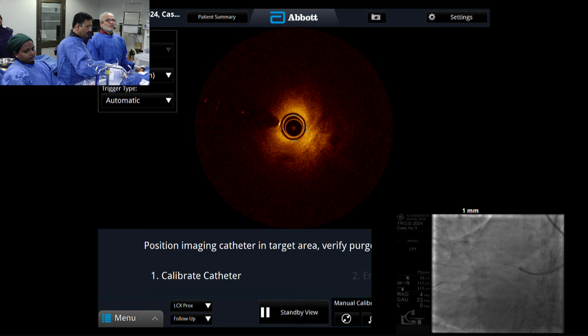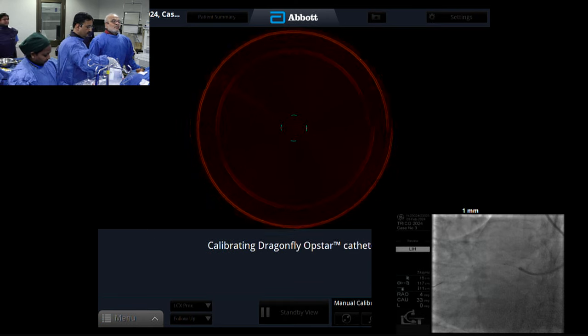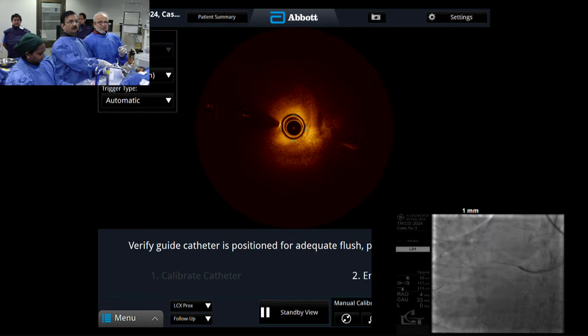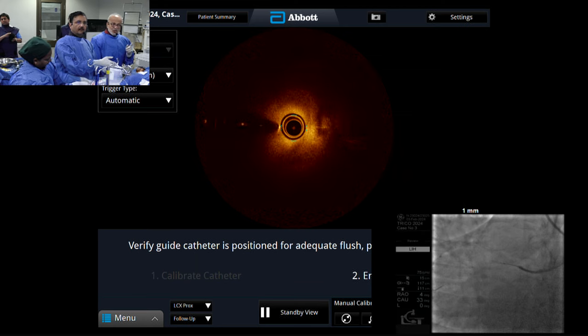Sir, I wanted to ask how to check the expansion, because at places it was 73%, 78%. And we know that it has to be more than 90%. I tell you one thing: adjust the reference bars. We have to use our clinical acumen rather than going by the book.